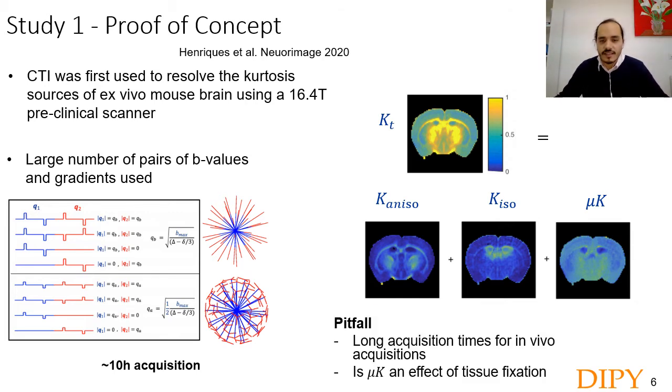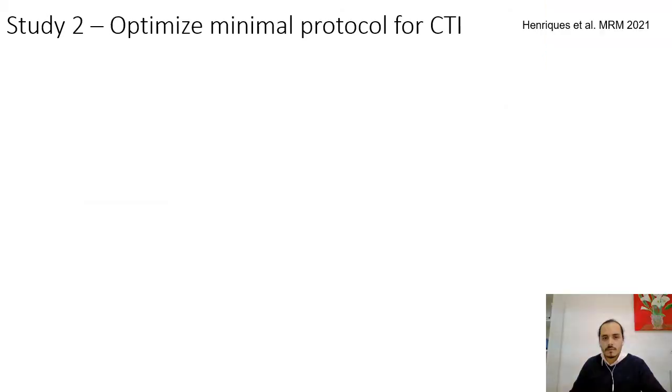A pitfall of this study is that the data was acquired with long acquisition times that were not compatible with in vivo acquisition. And also, since we did ex vivo acquisitions, we don't know if this microscopic kurtosis can be caused by fixation effects.